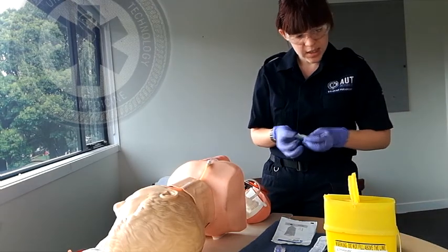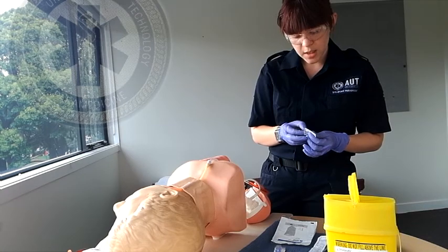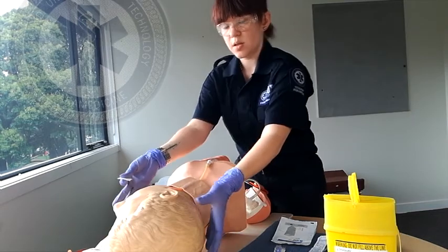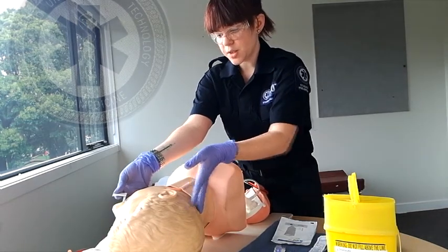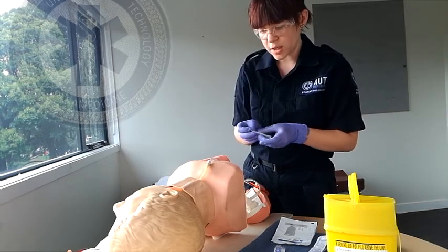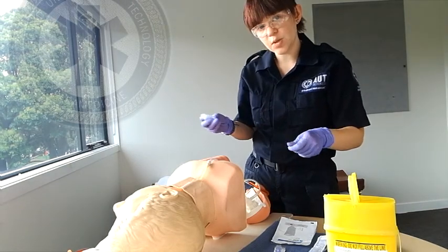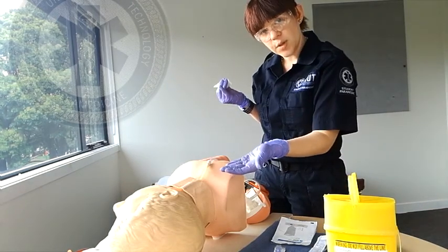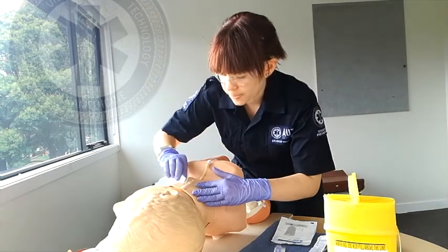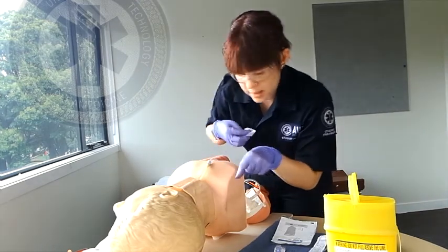I'm going to swab the area of skin where I'm inserting the cannula. I have the patient in a supine position with his head tilted to my right, his left, to give me better access to his jugular vein, which I can see quite clearly and I'm happy with. You can also place your patient with their legs up in the Trendelenburg position to assist. I'm just going to swab the skin now, wiping on the back of my gloves so I know when it's dry.